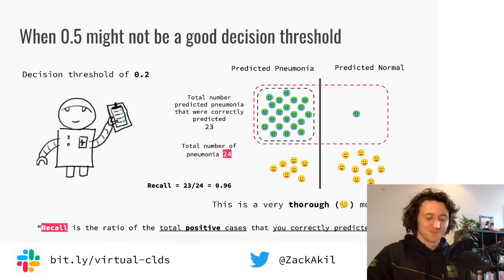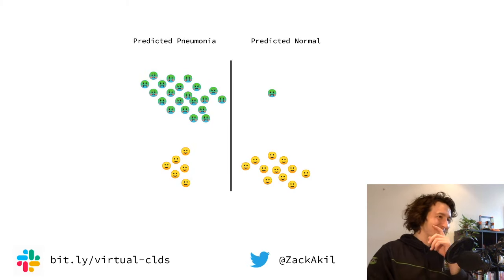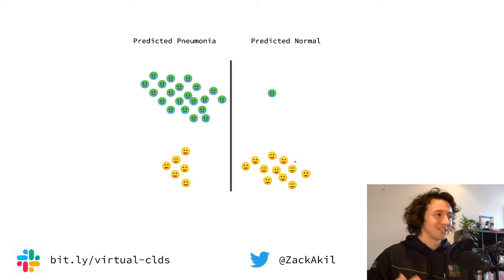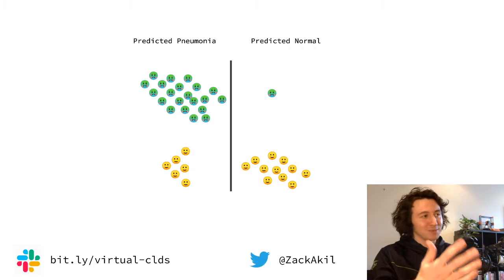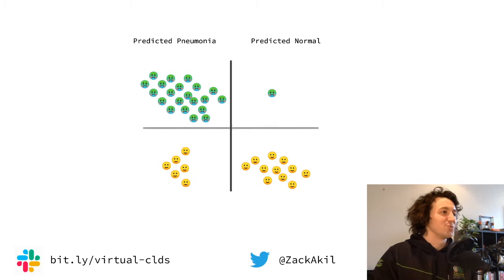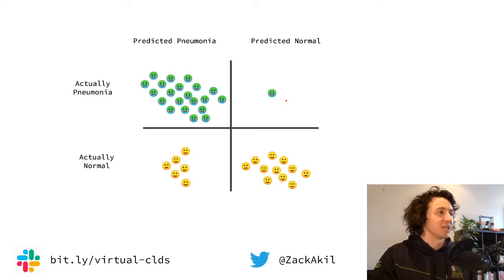So that's recall. All right. So this little chart we've been showing again. This is an insanely wordy topic, so don't worry if it's getting confused in your head. But let's look at this. This is the little chart I've been showing you. This chart is actually used a lot in machine learning. So if we put an axis just there, and we put these words here, everything on the horizontal, those are the actual labels.